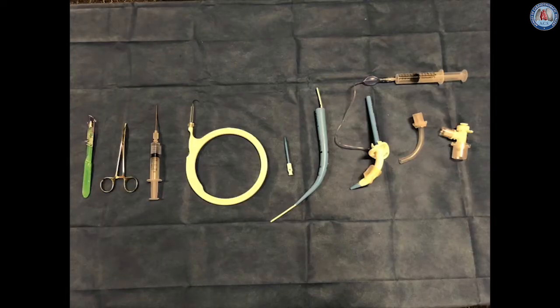The equipment required for percutaneous dilational tracheostomy is packaged in a standard Siaglia Blue Rhino kit manufactured by Cook Medical. Necessary equipment for safe and efficient technique are shown here and include, from left to right: a disposable 15 blade scalpel, a mosquito clamp, and a 15 gauge introducer needle on syringe partially filled with saline.